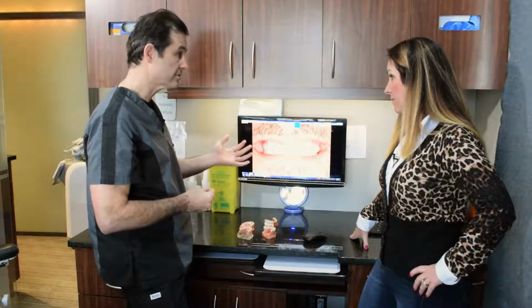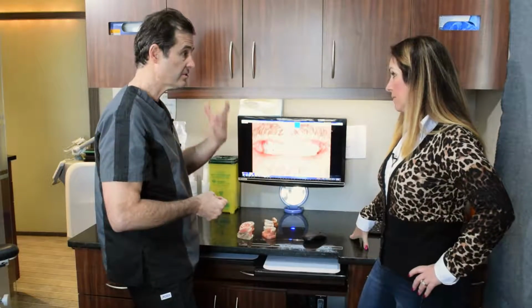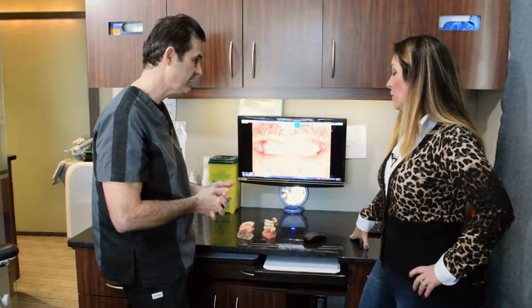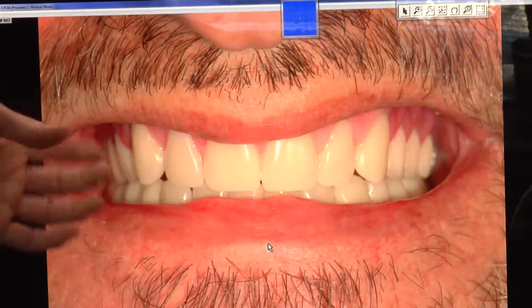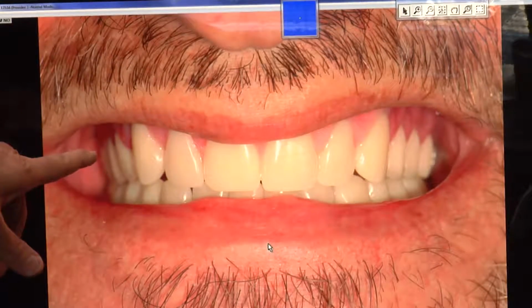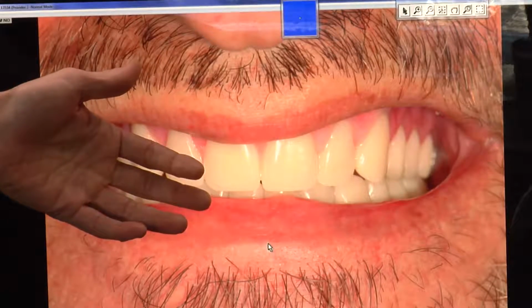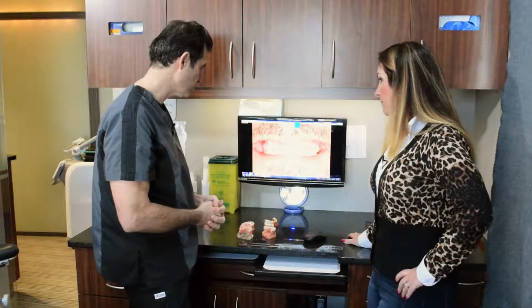If you were elderly, if you were going to be in a home, I would much rather have something like this that you can take out. The nurse can take it out. You can clean it. It's very easy to maintain. So that's the pros of this. The cons are it's still a denture. These teeth are going to wear out in time. They're plastic. You could drop it, chip a tooth or something like that. Easy to fix, but also it's possible to wear down.